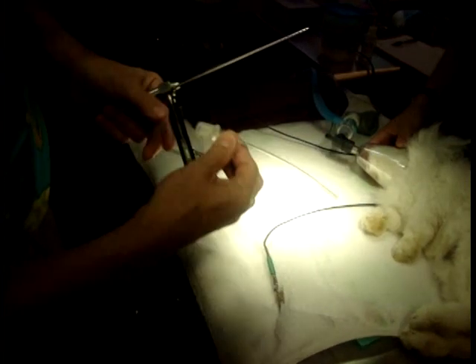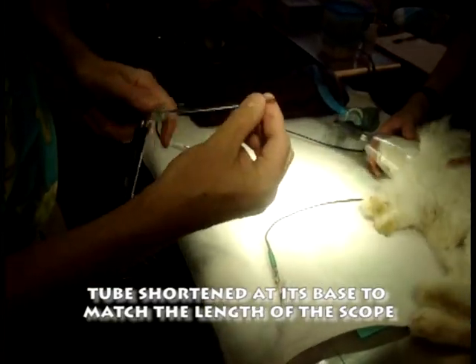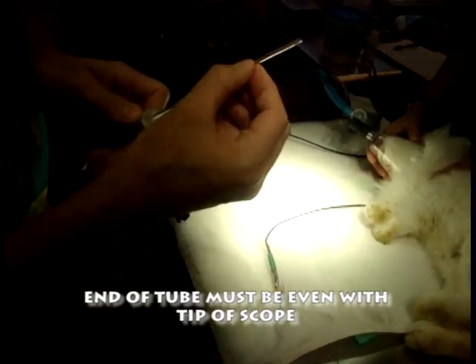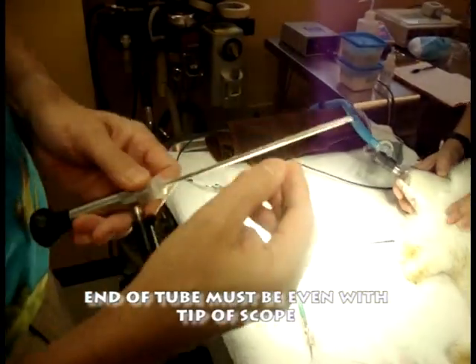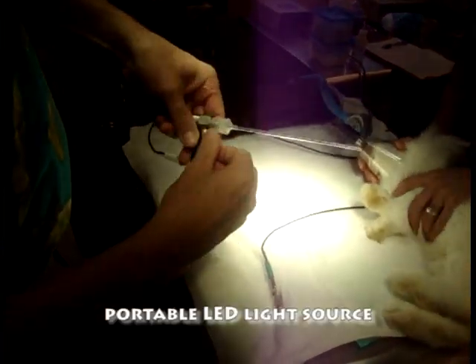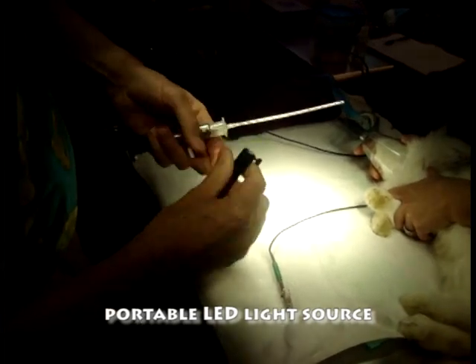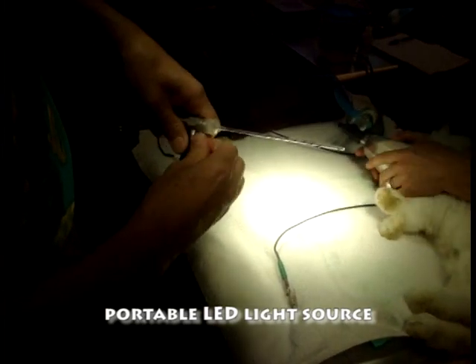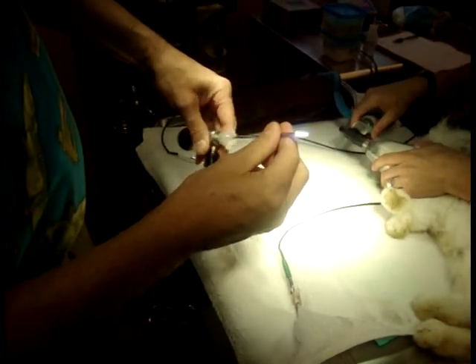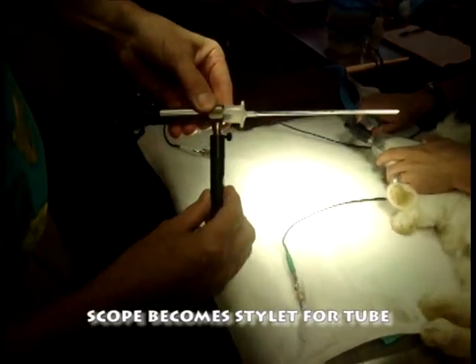I've modified this tube and cut it short so that it comes just to the end of this endoscope, just even with the end. I am using MDS's portable LED light source, which we can attach here — it uses a handle, and you can see the light source comes right to the end. We can see out the end of our endoscope.